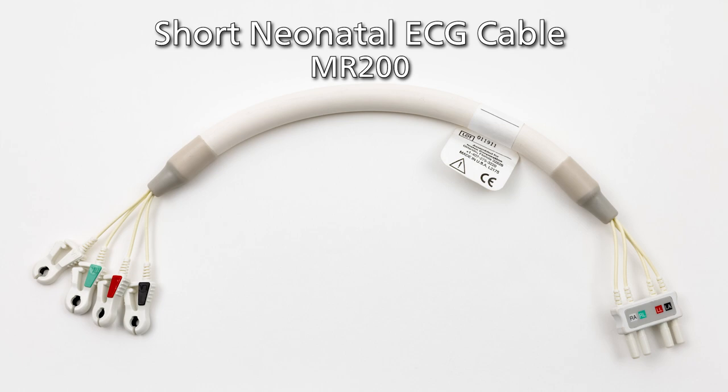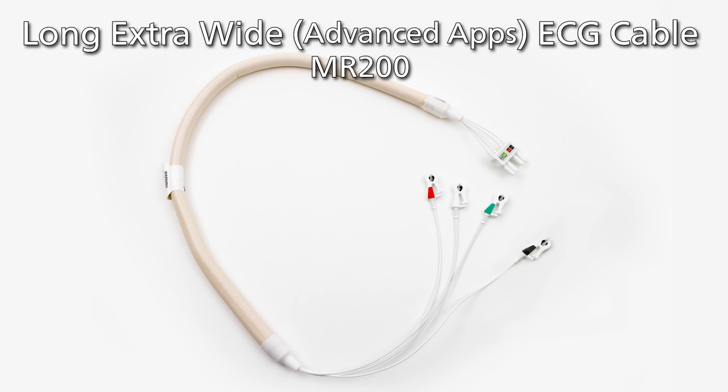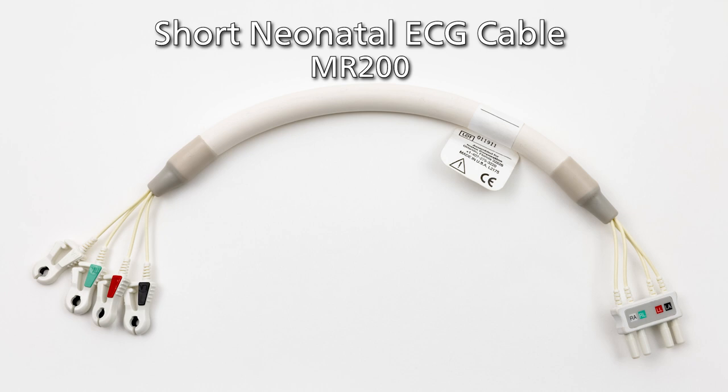The long wide ECG cable is designed to minimize the gradient artifact on the ECG trace for all patients greater than 10 kilograms. This cable can be used with either the multiple patch or single patch ECG electrode. The long extra wide ECG cable is designed to allow for wide electrode placement on patients with greater surface area of the chest, such as female or overweight patients. This cable can be used with either the multiple patch or single patch ECG electrode. The neonatal ECG cable is designed for infants weighing less than 10 kilograms and should be used with the neonatal ECG electrode.